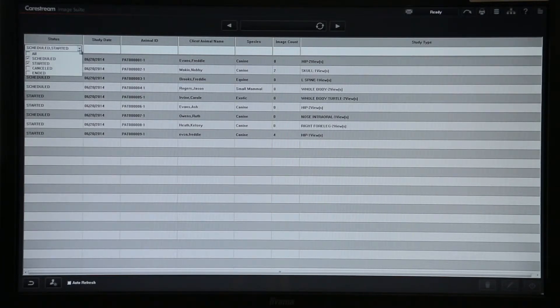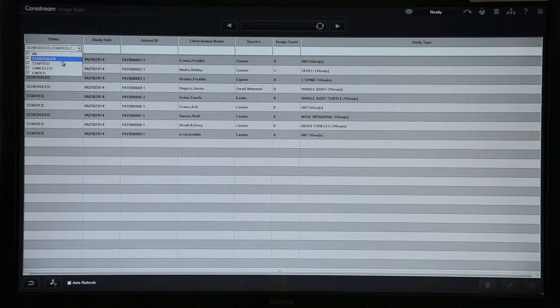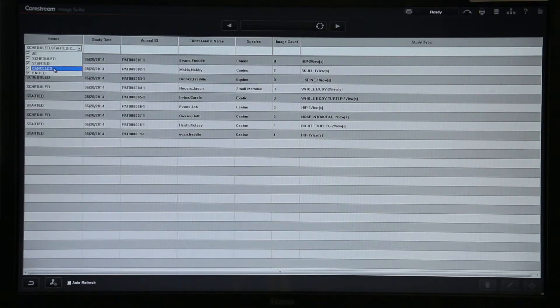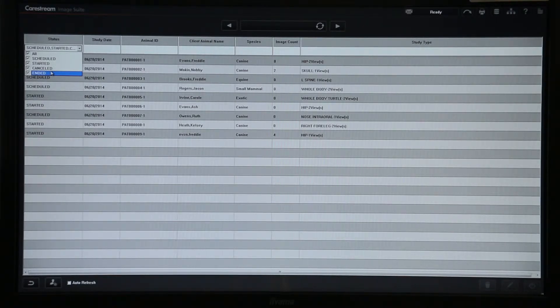If you click into status you can see the various statuses that an image can have. Scheduled is a patient who's been put onto the system but doesn't have any pictures. Started is a patient who's been started but hasn't been ended yet. Canceled is somebody that you've decided doesn't need an X-ray. Ended is where all your completed patients should ideally be, and once you've ended a patient this enables you to see the images via your mini packs around the practice.